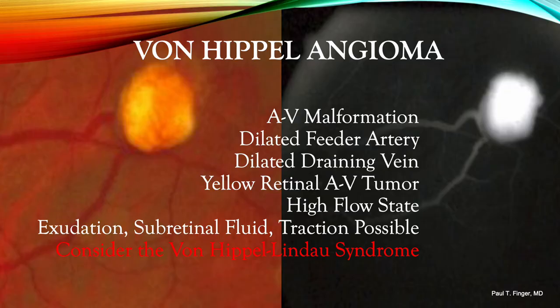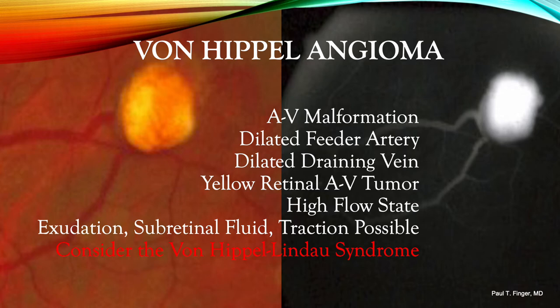Another and more common retinal vascular tumor is the von Hippel angioma. The underlying pathophysiology is one of an arteriovenous malformation. There should be a dilated feeder artery and a dilated draining vein, both best seen in the early phases of the fluorescein angiogram. This anomalous high-flow retinal vasculature comes together and forms a yellow retinal tumor, which can lead to exudation, subretinal fluid, or retinal detachment with retinal traction. Patients with von Hippel angiomas may have von Hippel-Lindau syndrome, associated with multiple endocrine neoplasia including pheochromocytomas, pancreatic cysts, renal cysts, renal cell carcinoma, and cerebellar angiomatosis. These patients should be managed with a neurologist.